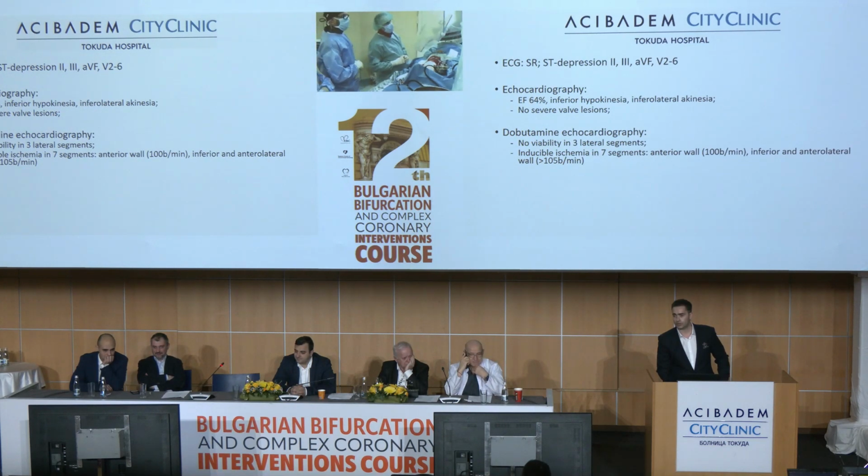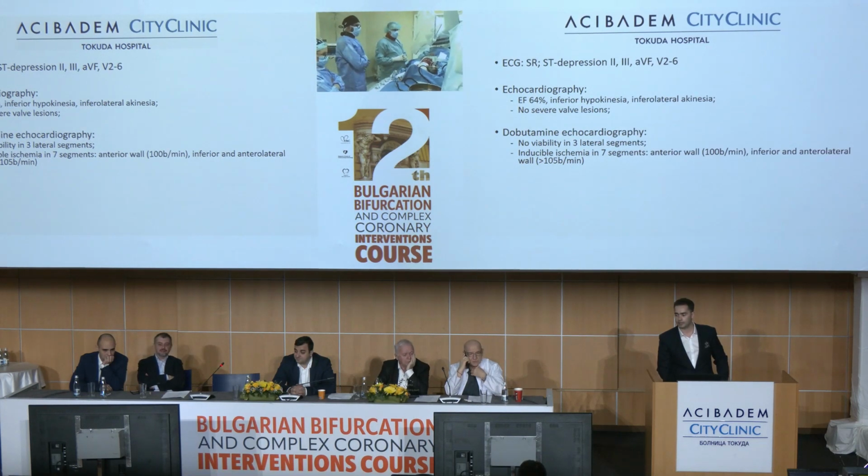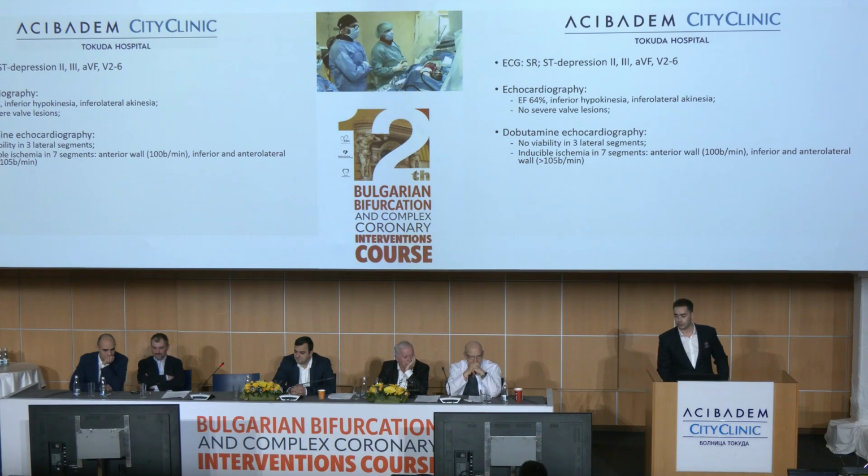From echo, preserved left ventricular function with inferior hypokinesia and inferolateral akinesia. We performed dobutamine stress echo with no viability in the 3 lateral segments, but also inducible ischemia in 7 segments. First in the anterior wall, and after that, the inferior and anterolateral wall.